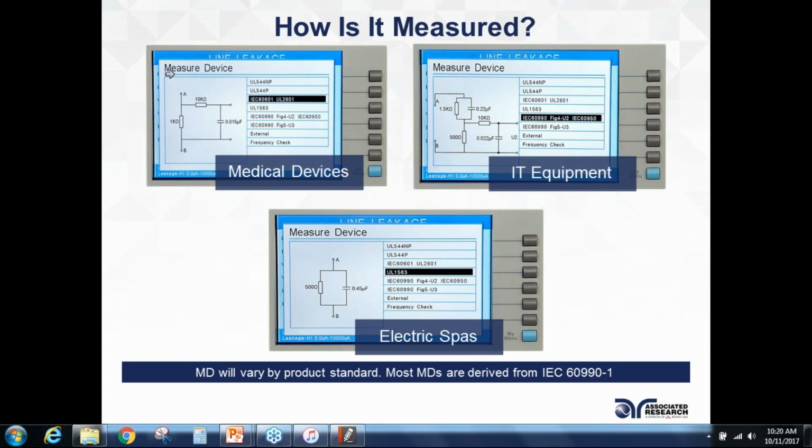So we have the medical device here. This asks to have a 1K ohm resistor. Normally that's what they ask for. And then there are these frequency responses where they're checking for more than just the 60 or 50 hertz that may come through. So if something else is leaking in your product, let's say you have, for example, a defibrillator, and if you're connected to a defibrillator, it might be sending some current in different frequencies. So up to 1,000 hertz may be harmful to a human being.